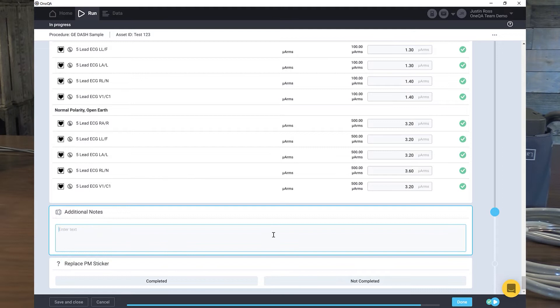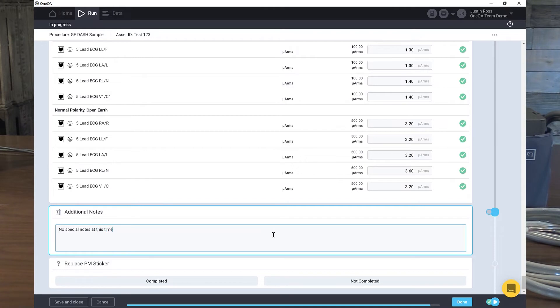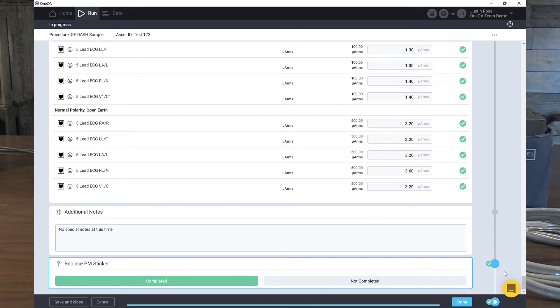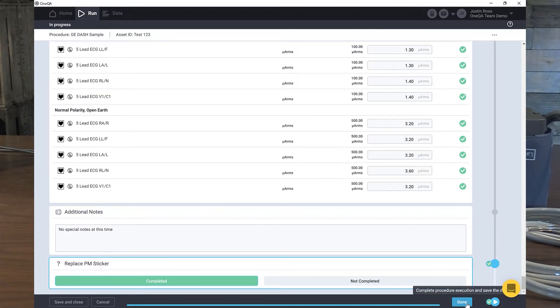No special notes. We'll put a PM sticker on it. That's our last green checkbox over here. At the bottom we have a green light, which means the PM procedure has been completed. We'll click done, and this is going to save it over to our reports.